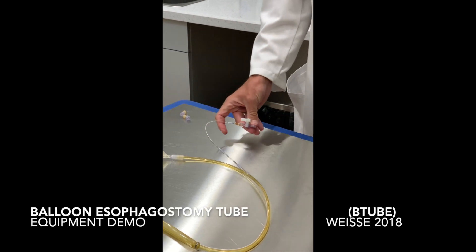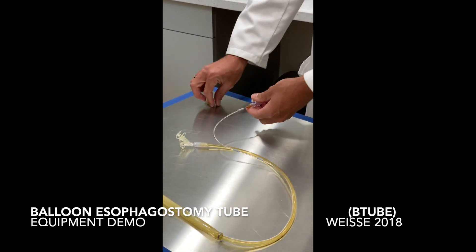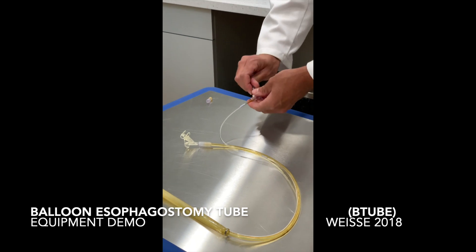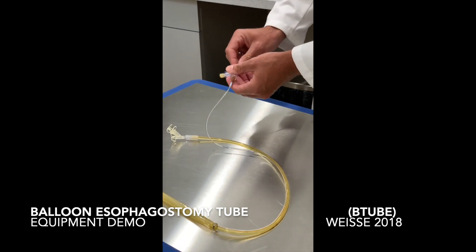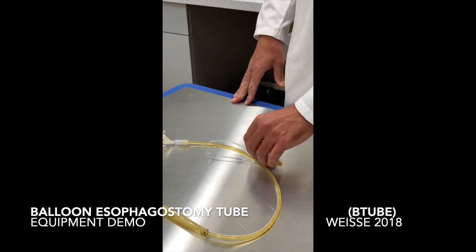This all comes off. We put our injection caps back on. It doesn't matter which one goes to which - they're both interchangeable. And now we feed Mackie.